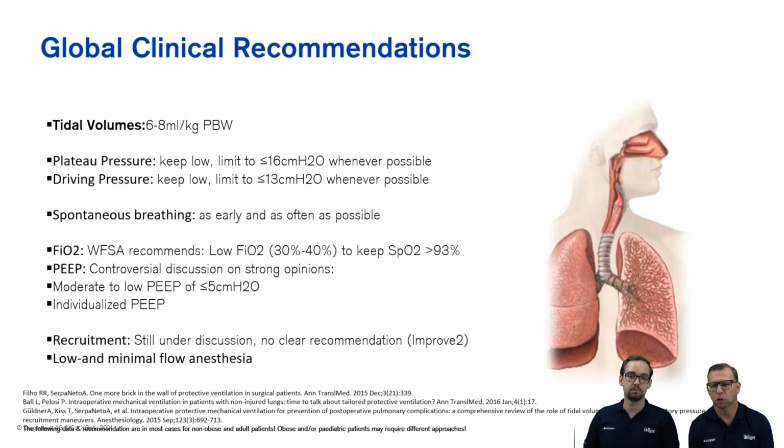They're targeting tidal volumes of 6 to 8 mils per kilo of predicted body weight. So not actual body weight. It's about keeping plateau pressure quite low. So that goes against the idea of actually doing recruitment manoeuvres. But keeping your driving pressures low and keeping your plateau pressures low is going to be challenging in some circumstances, particularly if you've got a belly full of CO2 and a head down approach for surgery for 3 or 4 hours. Spontaneous breathing as often and as early as possible in every case, keeping your FiO2 quite low.